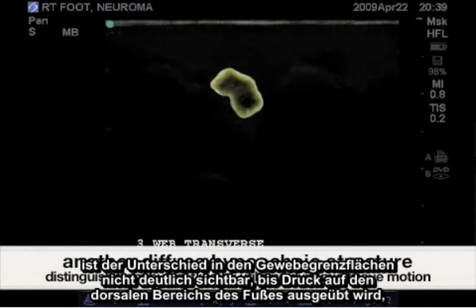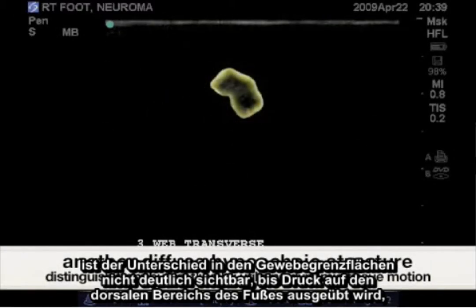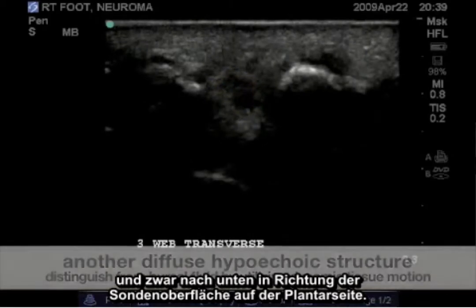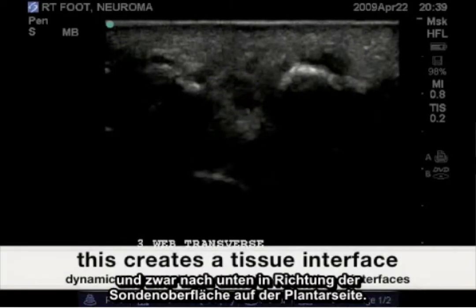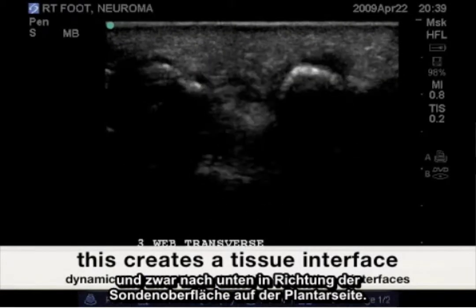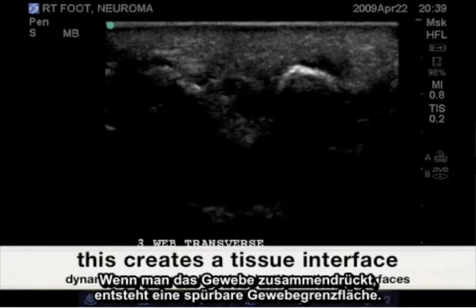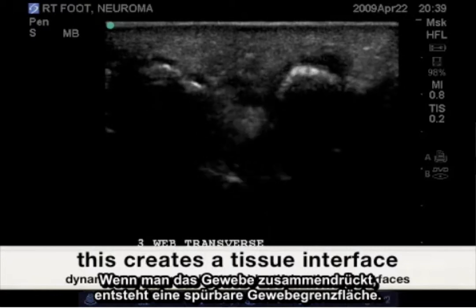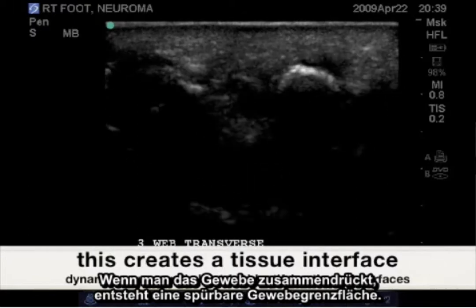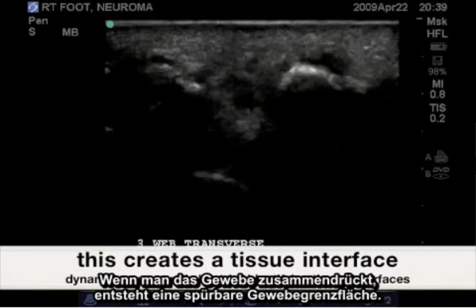Until force is applied from the dorsal aspect of the foot, with pressure downward towards the probe's surface on the plantar aspect, forcing these tissues together creates a more noticeable tissue interface.